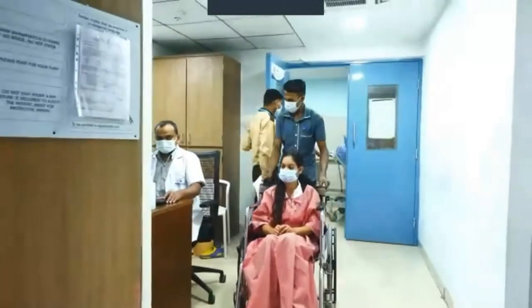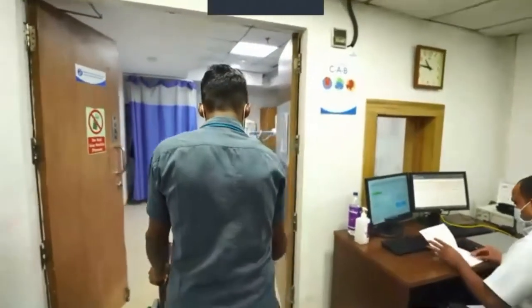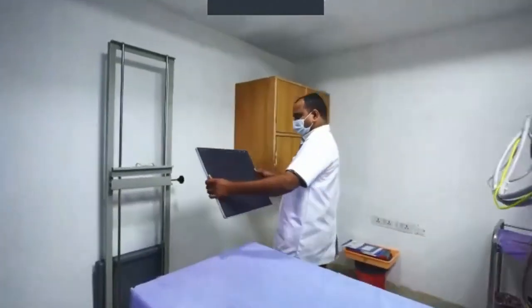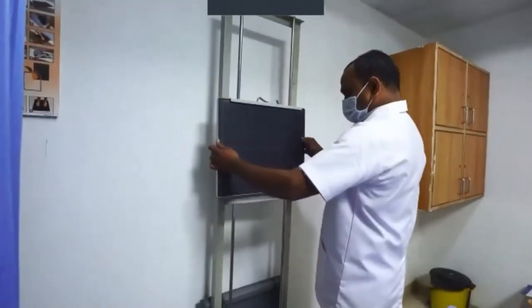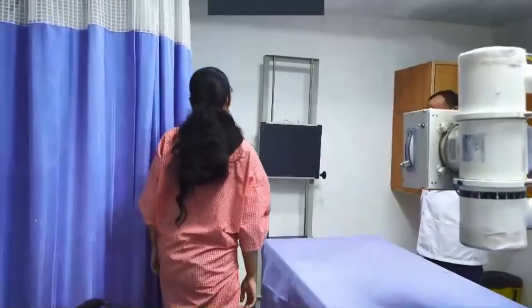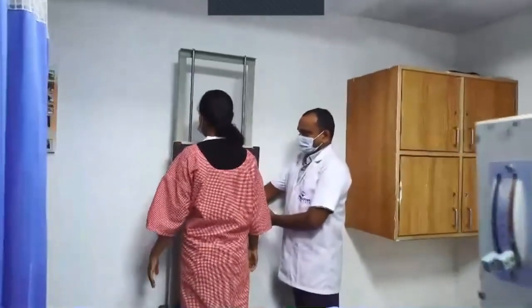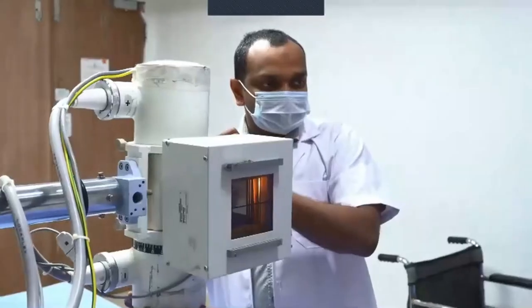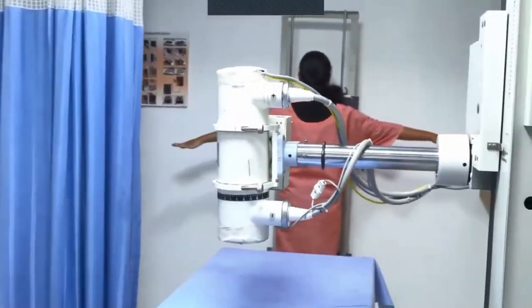The patient is taken into the X-ray room and the requisition is given to the technician. The patient goes inside and the technician places the detector on the chest stand. It's a lightweight detector. The patient is asked to stand in front of the detector for a chest PA X-ray. Then he positions the patient so that exactly at 6 feet distance you can expose a good chest X-ray. After positioning, he goes out of the X-ray room.